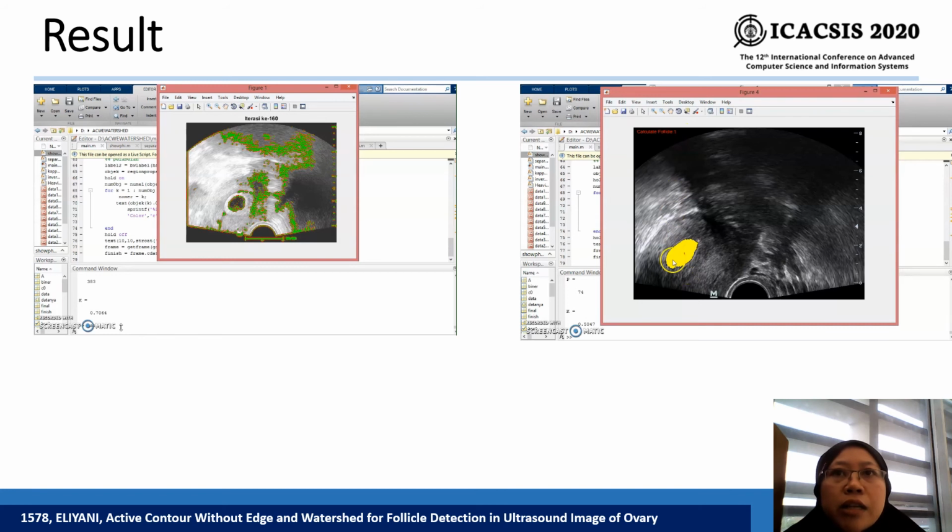This study utilized the maximum area value of the follicular object in the dataset. The maximum area value is called the area boundary constant. Objects that have an area value greater than the area boundary constant are considered attached follicles.